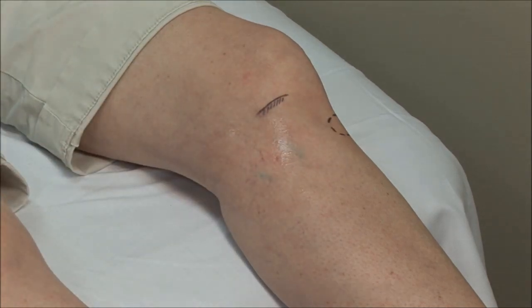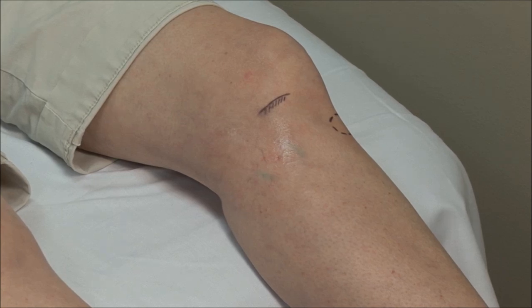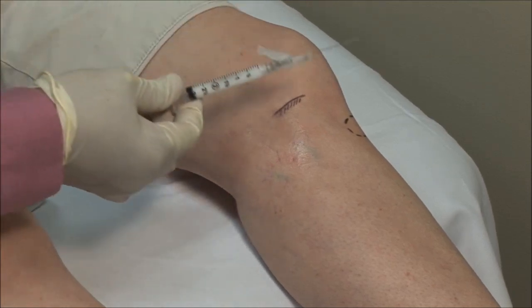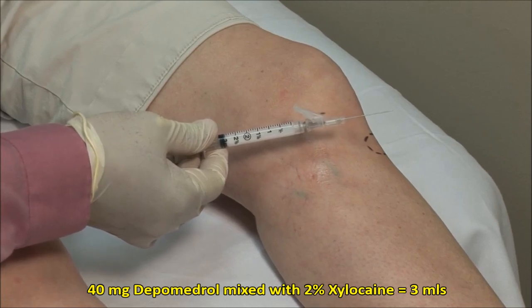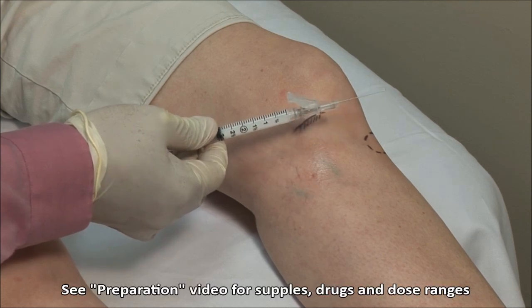Local anesthetic can be applied to the skin and subcutaneous tissue using a 25 gauge needle, but the experienced clinician may forego this. Here I have a mixture of 40 mg of depomedrol mixed with 2% xylocaine without epinephrine to a volume of 3 ml, and I am using a 22 gauge 1.5 inch needle.